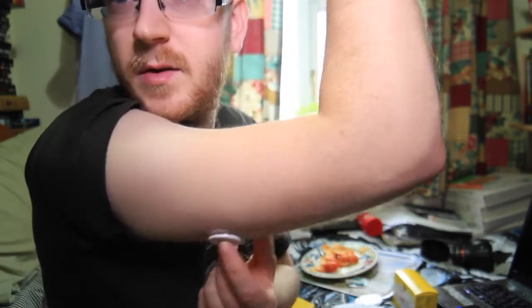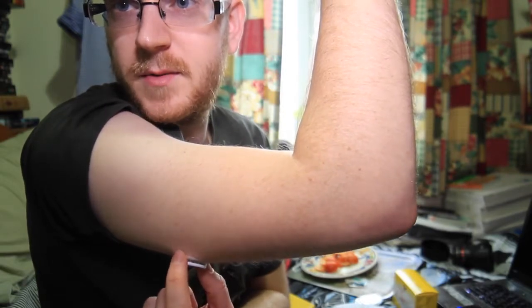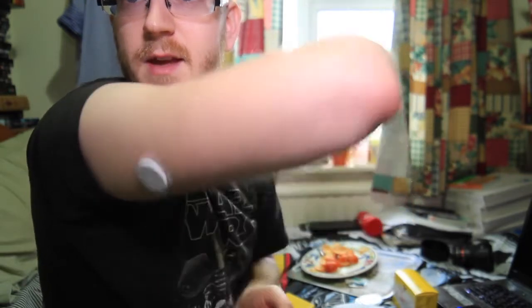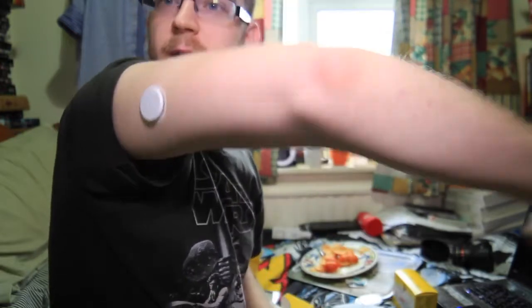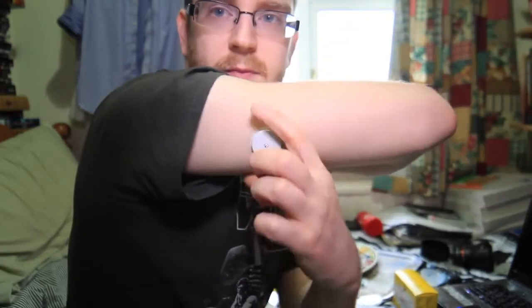The glue has it on quite nicely and tight. As I pull the skin, you can see it's pulling — it's secure. From a different angle, it's not sticking out loads from my arm, not chunky at all. It looks pretty cool.